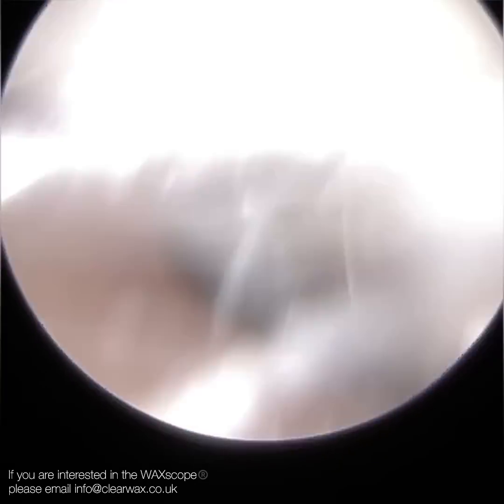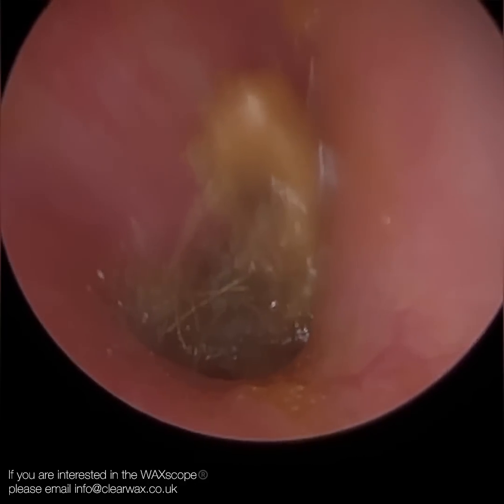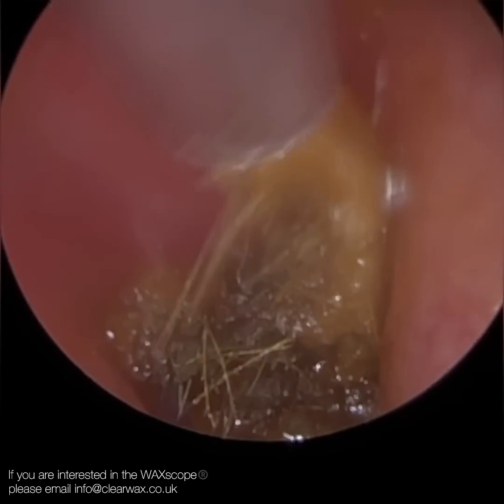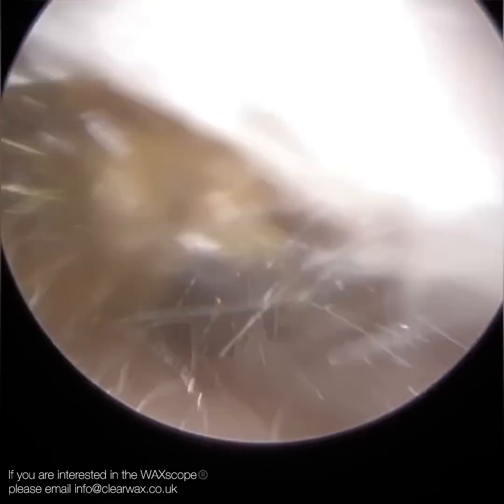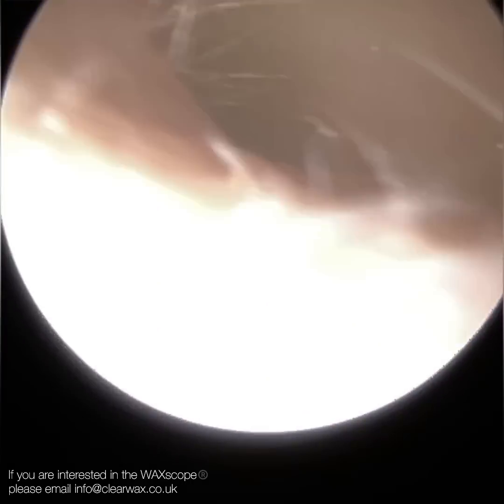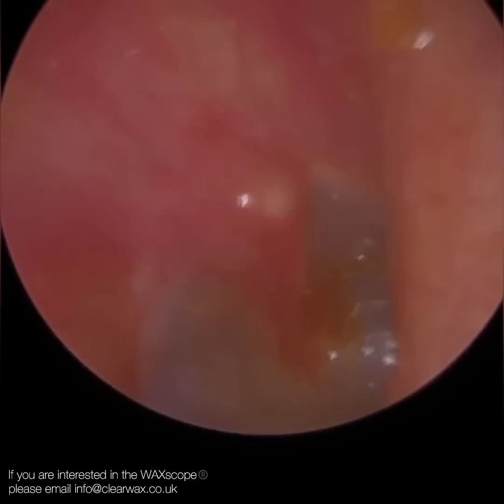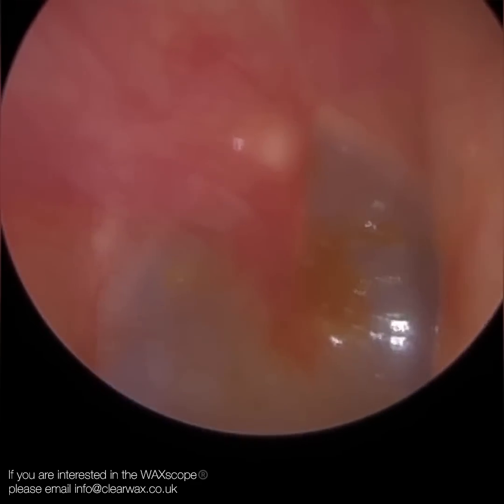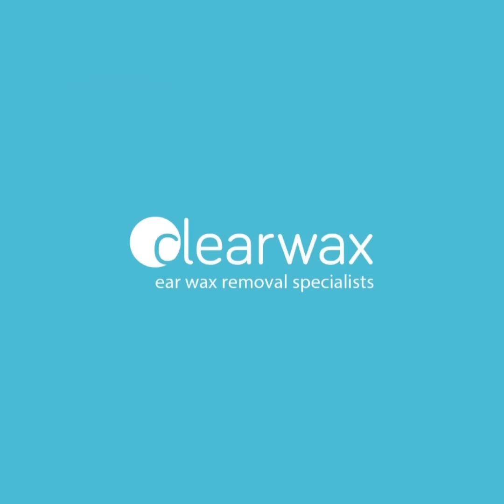Those are the hairs at the entrance — they can smear the lens a bit. There are also a few matted hairs here, which can sometimes suggest wax has been pushed in, though they can also become loose and fly into the ear. You can see how bendy that ear is. Just straightening it up — you can see the whole eardrum now. That's the debris from both sides. I really hope you enjoyed that video. If you're interested in the Waxscope, please email info@clearwax.co.uk. Thank you. Bye.